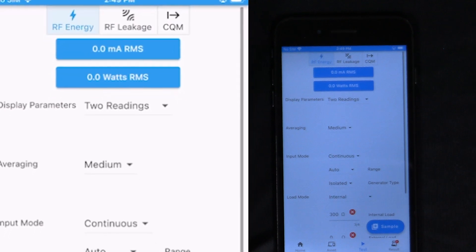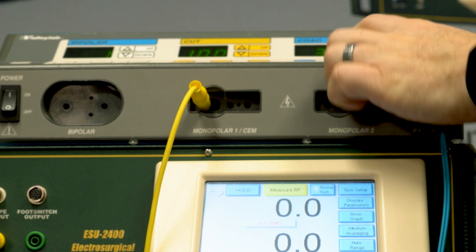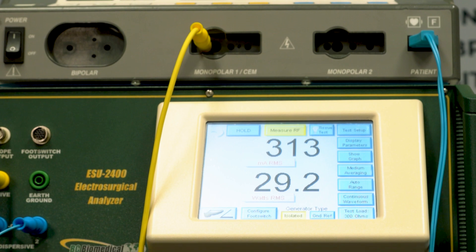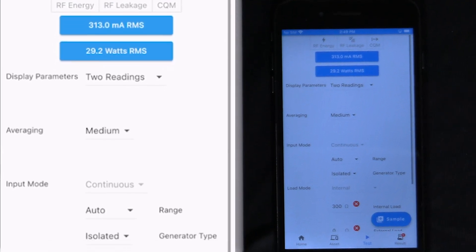If I need to make additional readings, let's say measuring coag, I can do that here. Set the power level, press the coag button and my measurement will show on MyBC Mobile. Press sample and now that's stored.